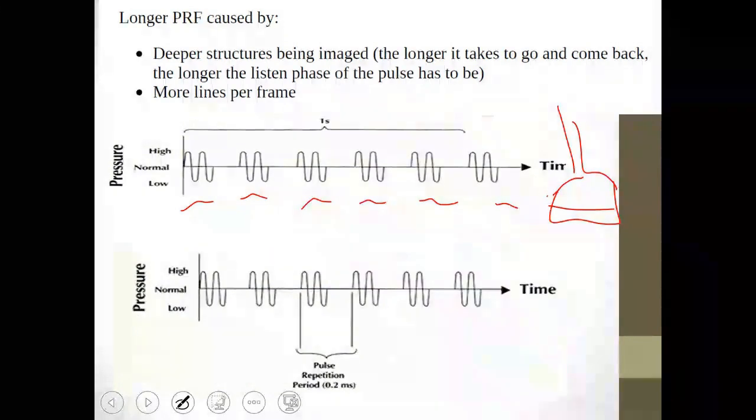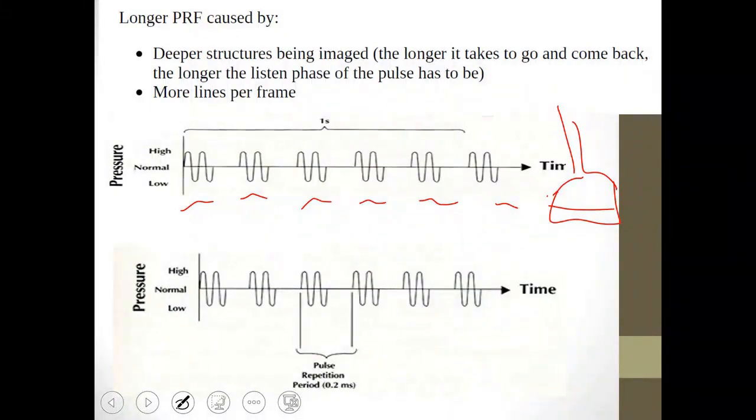Okay. If I say that the image is working, it means that while I have the probe on the patient, there was a transmission of the pulse, and there was a reflection of the pulse that came back, and I received it and translated it into an image in a simple way. So this frame or image is essentially made up of lines. What does that mean? It means that inside the transducer itself, there is a crystal or the elements that I was talking about, looking like this.